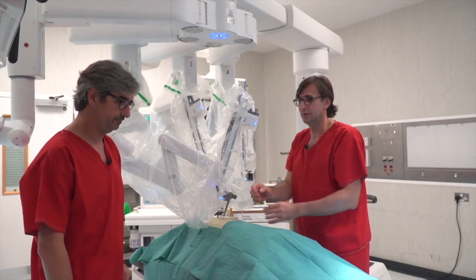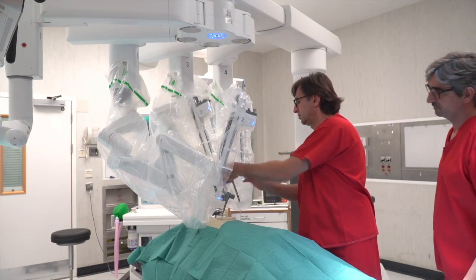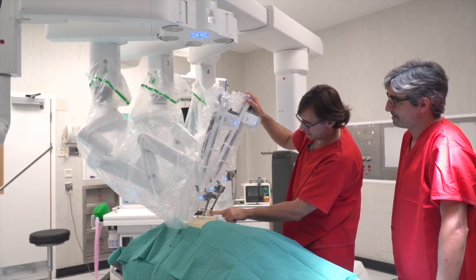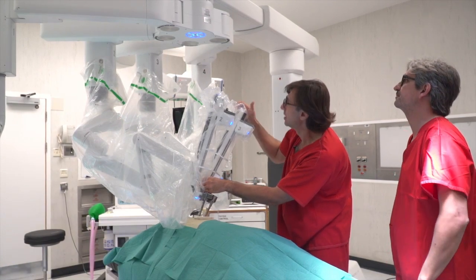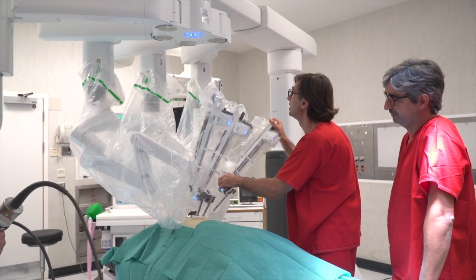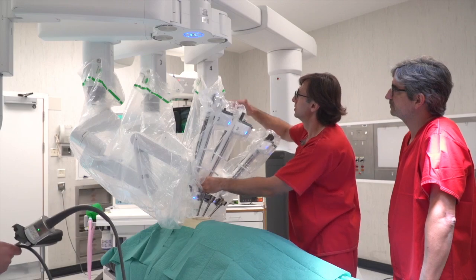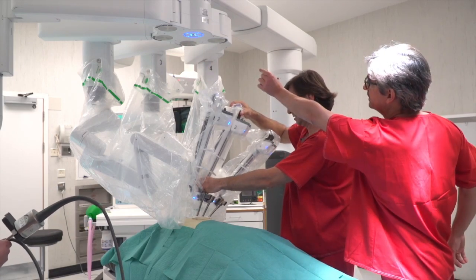So, the second trocar. Thank you. Put all the trocars now. Give me the third trocar. Thank you. We put the trocars. And then, with this big black mark at the edge, the range here — third arm, like this. Equal space there, in the middle of the letters. Maybe two separations — three and four, a bit closer.